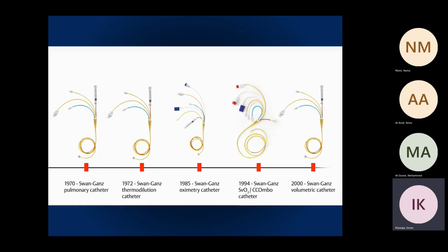Over the years there has been refinement. After the first version in 1970, thermodilution was added, and other features were incorporated.